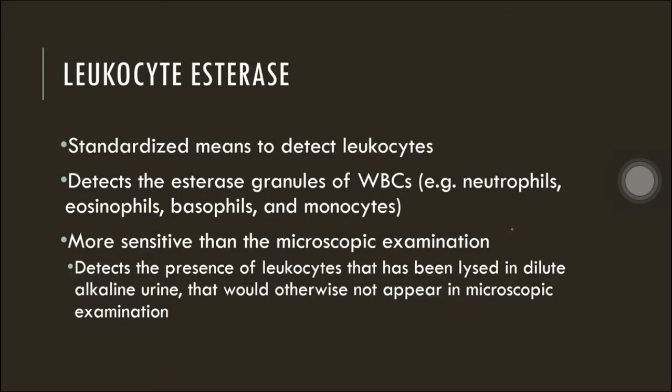Bakit? As compared kasi with the microscopic examination, for leukocyte esterase in the chemical examination, it's trying to detect the presence of esterase granules of WBCs, not the concentration or the number of the WBCs, okay? Which is done in microscopic examination. Okay, dito kasi yung presence ng granules. So sino-sino ba yung mga WBCs na may granules? Okay, yung mga granulocytes, such as neutrophils, eosinophils, and basophils, with an addition of the monocytes. So take note, sa lymphocytes, wala siyang esterase. So kapag may presence ng lymphocyte, magne-negative yun sa leukocyte esterase.